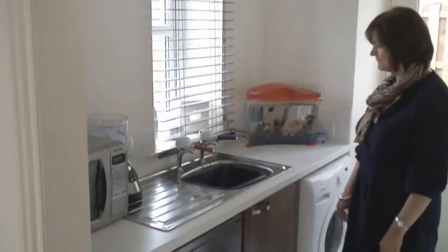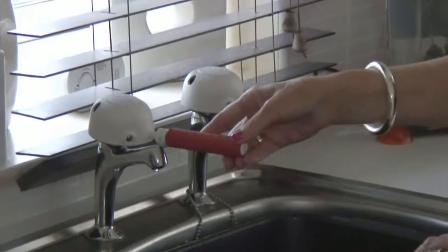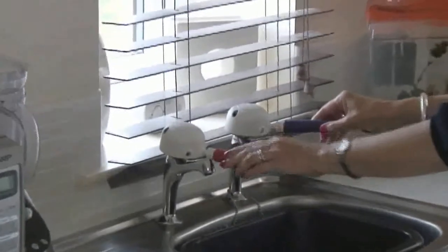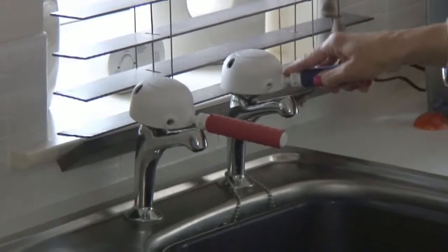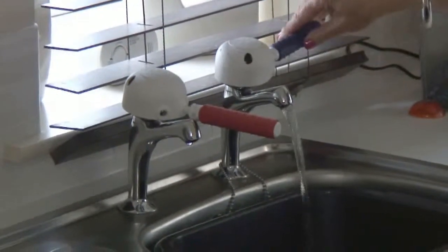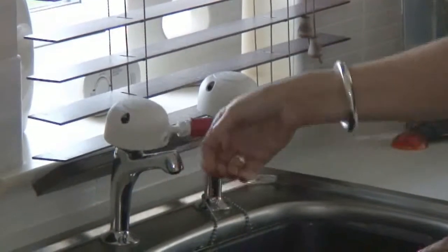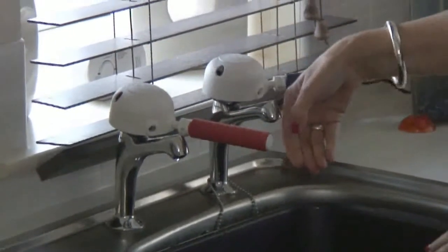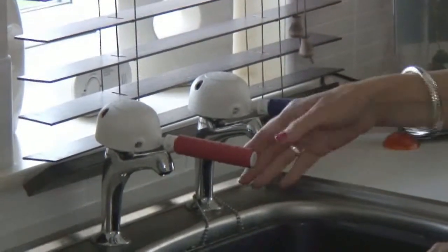One other item which can be helpful in the kitchen is having ease of access to your taps. There are all sorts of different taps in kitchens. Many modern kitchens will now have lever taps, which are in general easier to operate. These tap turners though can be added to really most types of taps, whether they're crystal headed taps or star headed taps. What these will do is turn them into lever taps, which, if you have difficulty either reaching the tap or having adequate grip to turn your tap on and off fully, will make that job an awful lot easier. These items are removable and they're fitted really within a matter of seconds to your tap.